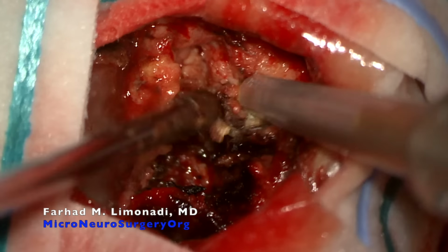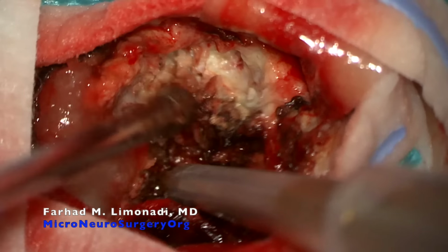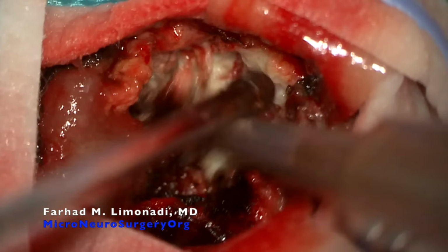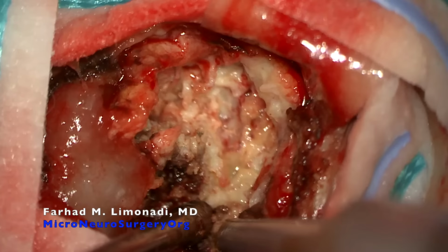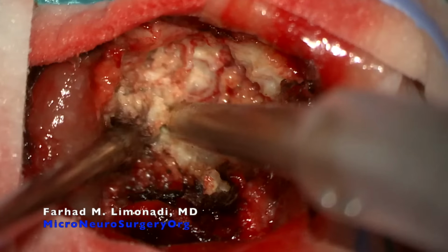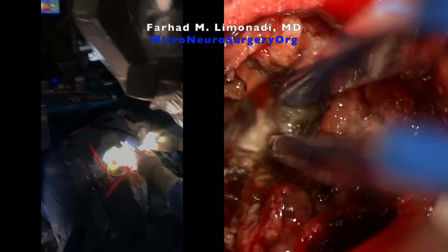Here we use an ultrasonic aspirator to core out the tumor along its edges. So we are staying on the capsule of the tumor.